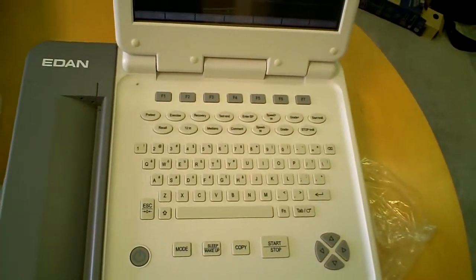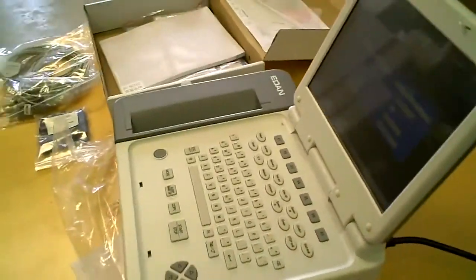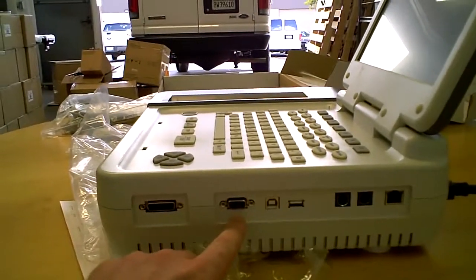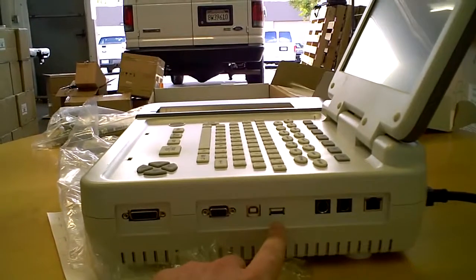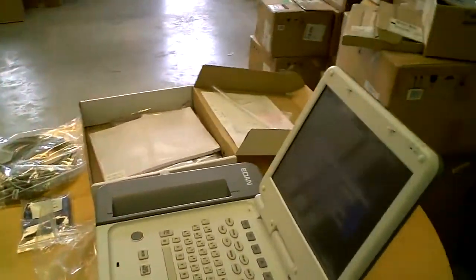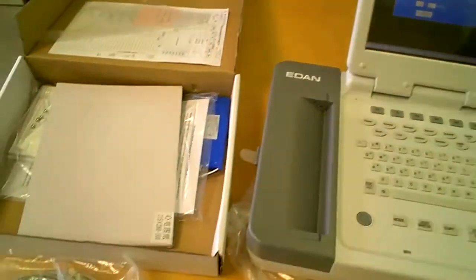It has a full keyboard and PC capability hookups. First of all, you have your serial patient hookup, your serial connection for data transfer, the USB hookup, and you also have the ability to network this machine. Remember that each one of our machines does come patient ready.